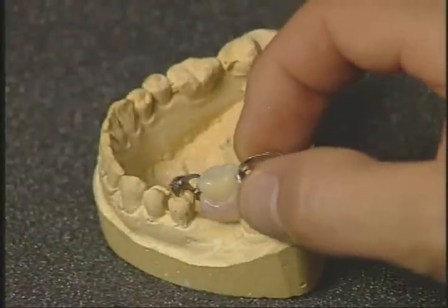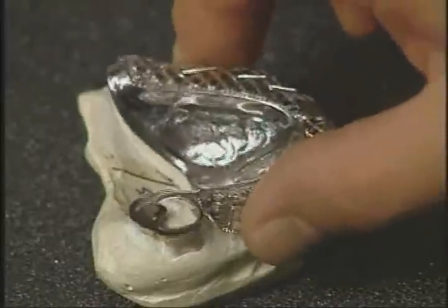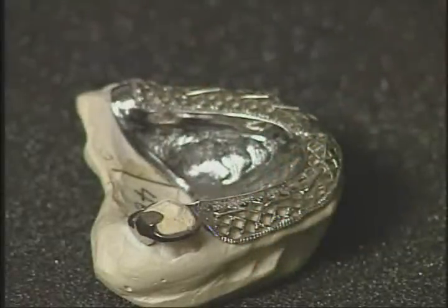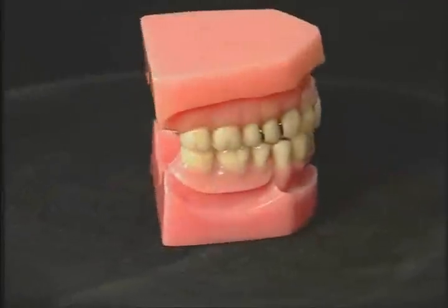Whether you are replacing only one tooth or only one tooth is remaining, the Equipoise partial denture system is the proven choice. If you want what's best for your patient's mouth, insist on nothing less than an Equipoise removable partial denture.